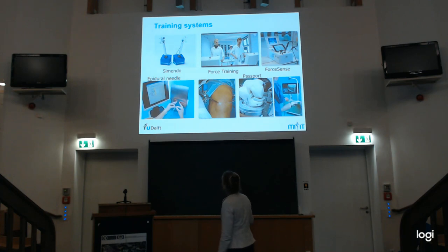This is fully virtual reality, you cannot feel anything in it. So we also developed a box trainer that you can use with normal tissue and normal instruments. They follow and measure path and forces. We also work on neuro research and training. We also developed a training for this. These two, we are still looking for entrepreneurs who want to make a product out of this.